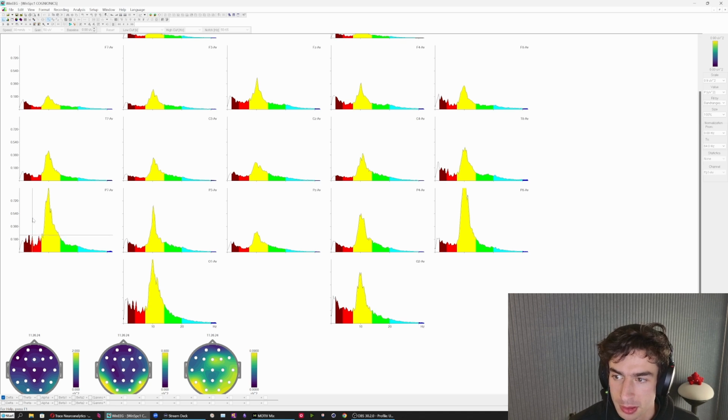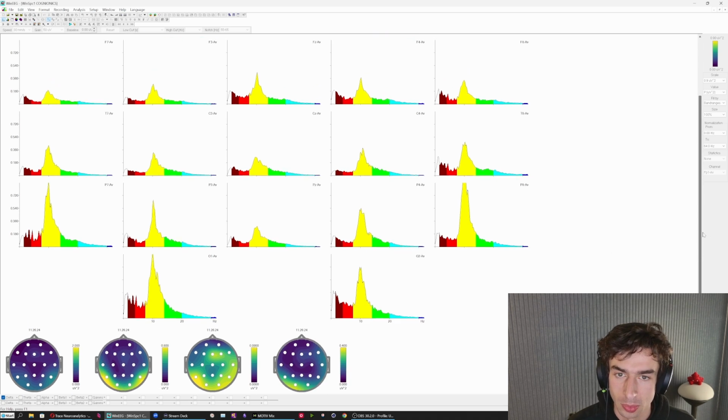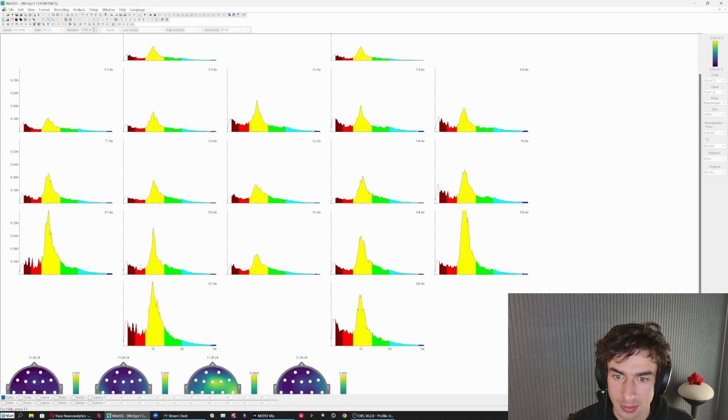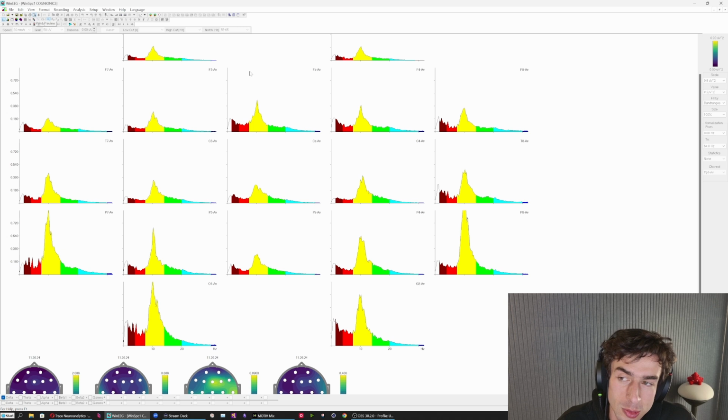And just for funsies, we pick out this little feature here, which again isn't really a peak, but points us to where there might be some of that spiky stuff going on. We did see it phase inverted front to back and also left to right. So we'll go to print preview so that we can get a view of this spectra that we can then screenshot. And WinEEG always likes to take its time with this first print preview.